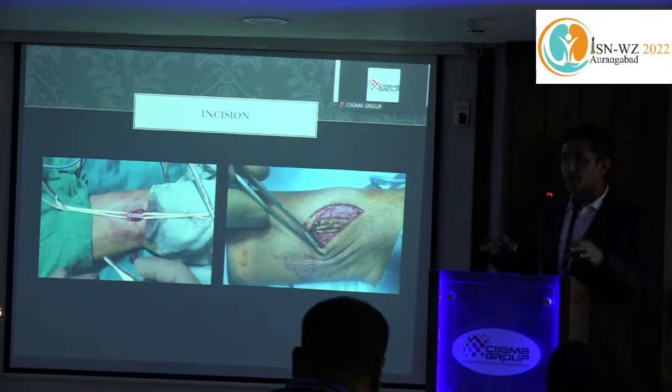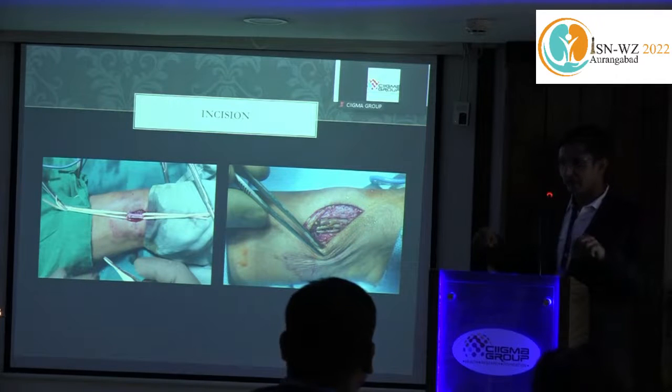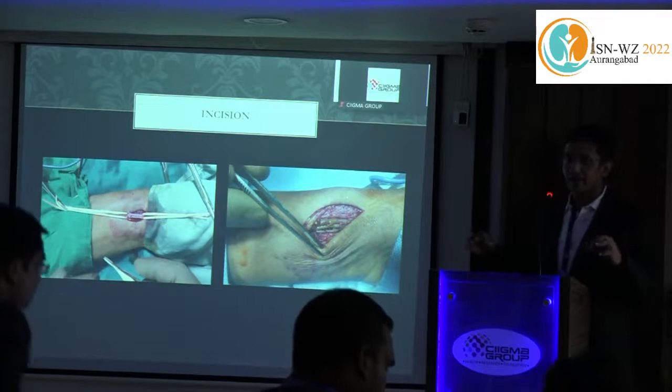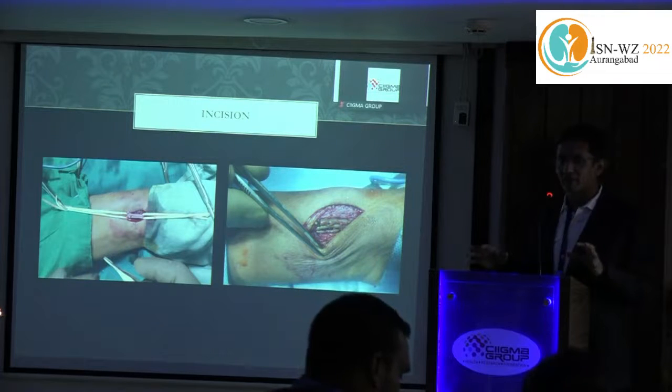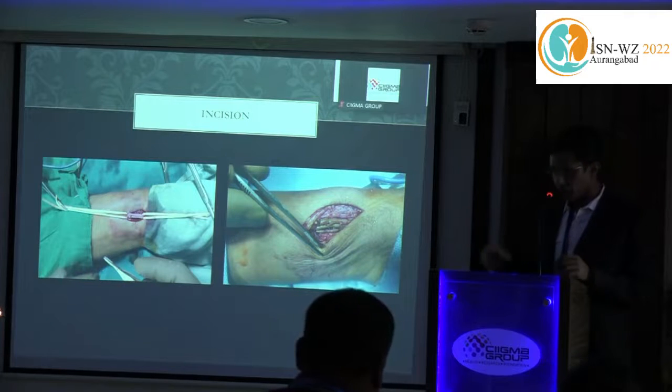I prefer that you have at least some space to put a bulldog and slings so that nothing goes wrong, because we are physicians, we are not surgeons. Over a period of time, yes, you simply put bulldogs and do the surgery. But in the initial days, mobilize the vessels completely, put slings, and only then start the arteriotomy or venotomy.